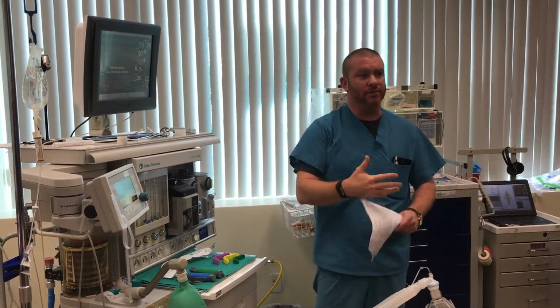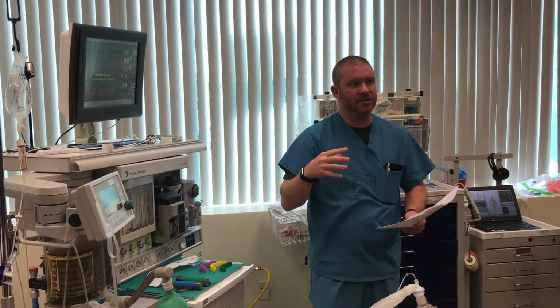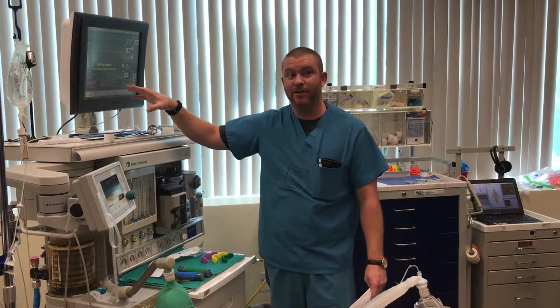You have no idea why, and you fumble trying to figure out why. You start giving drugs to fix the tachycardia, maybe Esmolol, having no idea why he's really tachycardic. It's a normal physiologic baroreceptor reflex. You're not putting it together because you're nervous, and then I'm starting to look at you funny, and it's this downward spiral. It can all be avoided by hitting the auto. Okay, does that make sense? I made a big deal about it. It's probably important.